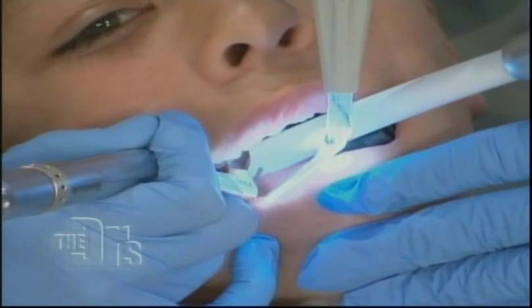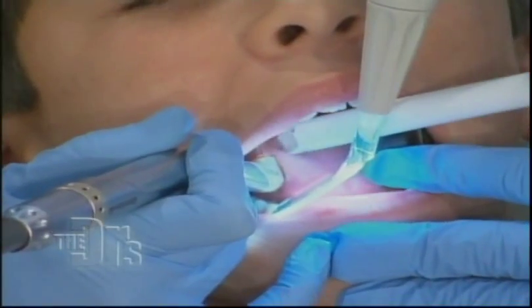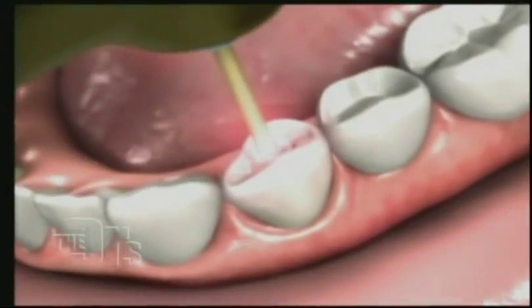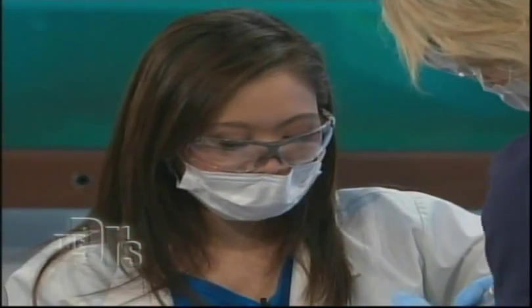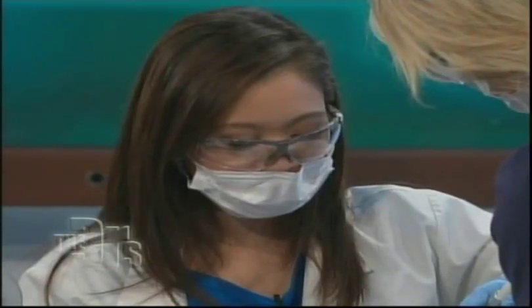That noise right there is the beam — the zapping sound. And you don't feel anything, right Zach? The Waterlase is like a high-power water gun or hose that chips away and removes the decay. What's really nice is you can have a very conservative restoration just by using water to take out the cavity. Once I know I'm back into hard tooth structure, that means we removed all of the cavity, which is great.